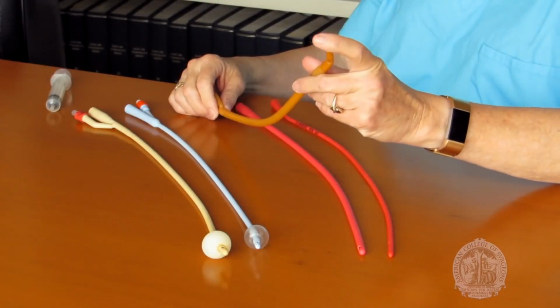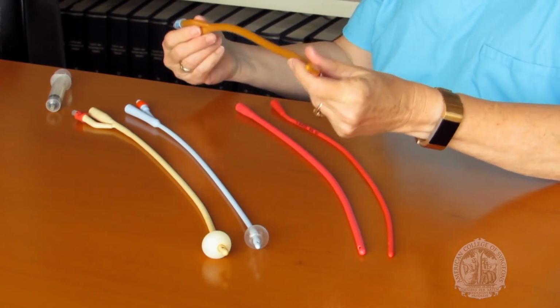Other forms of indwelling catheters also exist. The Coude catheter is a catheter with a bulbous tip and a curved end, and it's used for patients who have urethral obstructions, such as from benign prostatic hypertrophy. It's placed using a bit of pressure, but the principle of placing it is the same. It has a balloon and it's indwelling.